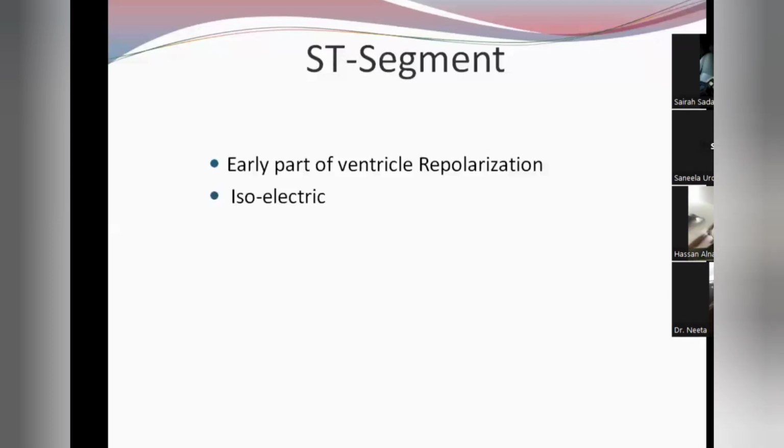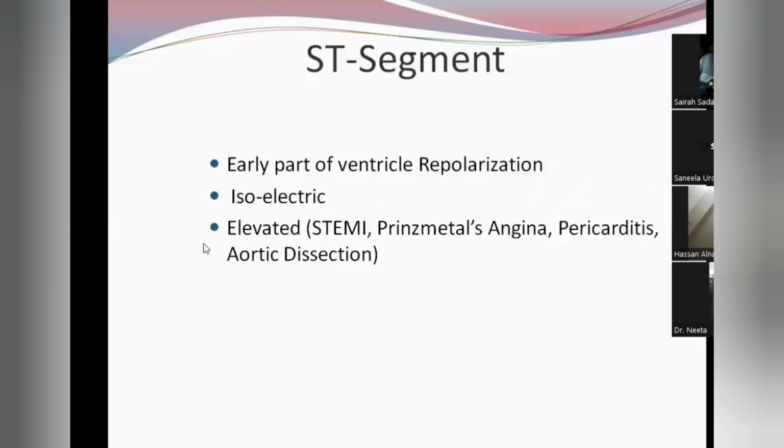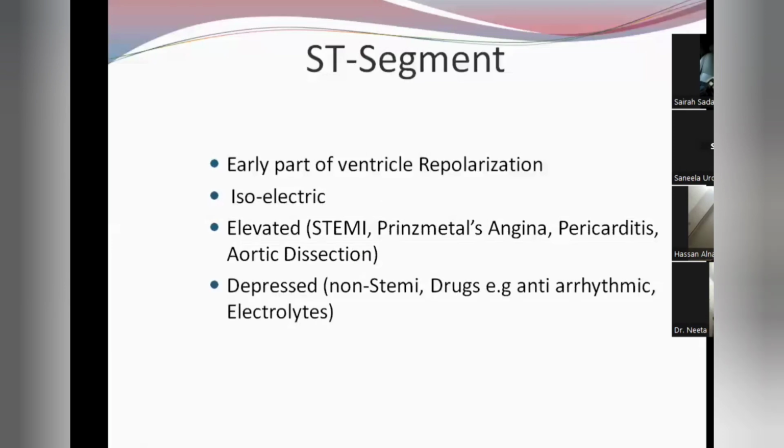Usually it should be isoelectric. Isoelectric means it should be flat, like this, not like this, not like this. It should be straight.